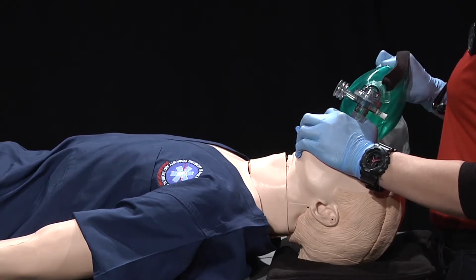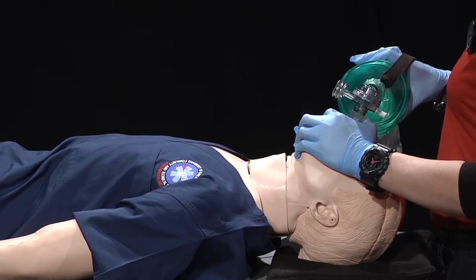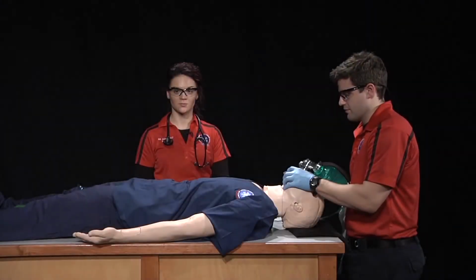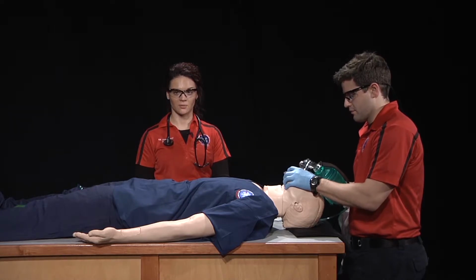I would continue to provide ventilations to my patient in order to pre-oxygenate them prior to the intubation. I would also attach a pulse oximeter to monitor their SpO2 readings. While my partner is pre-oxygenating my patient, I'll assemble my equipment.